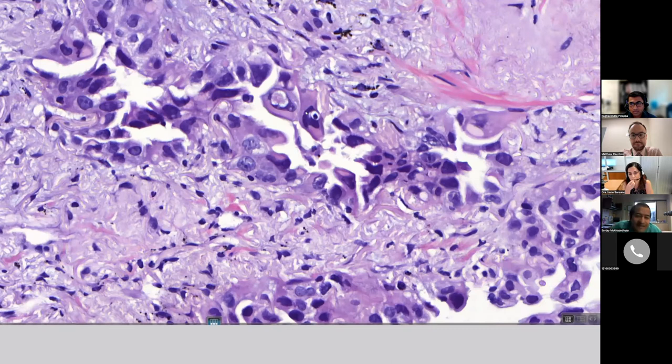Yeah, so I can try. So basically, we have atypical glands with an irregular growth pattern. Most of them seem to be acinar because they've got tubular or elongated glands with surrounding stroma. But if you see the overall growth pattern, they've got an irregular and infiltrative appearance, infiltrating into the surrounding stroma.